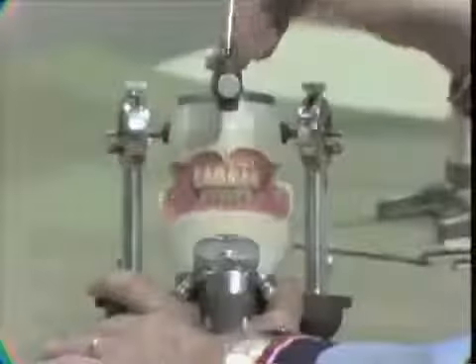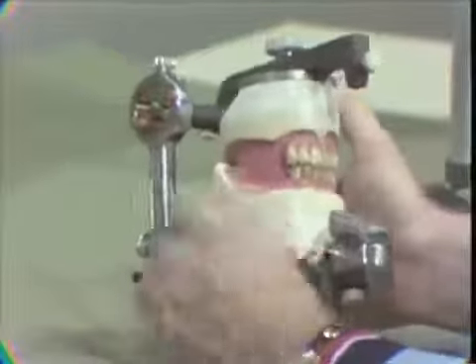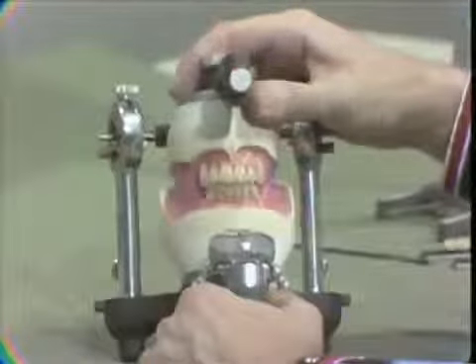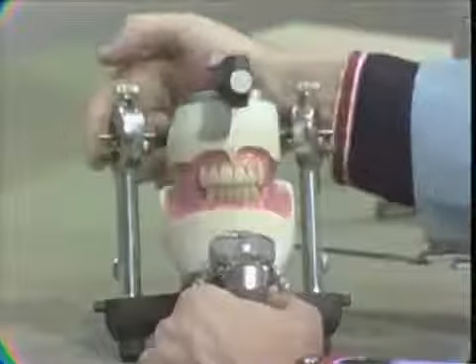The maxillary and mandibular 12 anterior teeth have now been set according to the previously stated requirements. The incisal pin has been removed for demonstration only and should not be removed arbitrarily when setting the teeth. The condylar mechanisms have been locked during the setting of the anterior teeth.